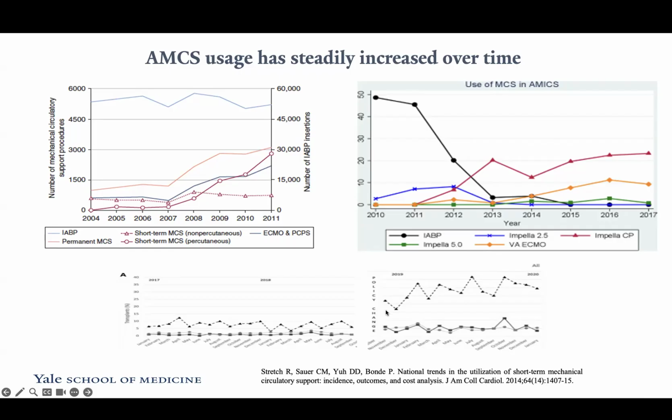And that was followed by an increase in balloon pump use after the UNOS criteria changed. So now you can be a UNOS 2 for a heart on a balloon pump, similar to a 5.5. So that raised the use of balloon pump for heart failure.